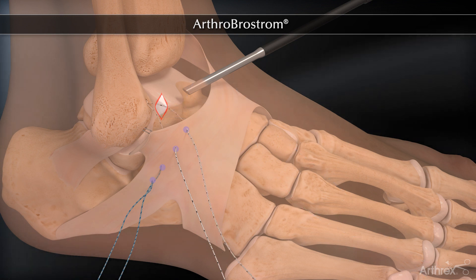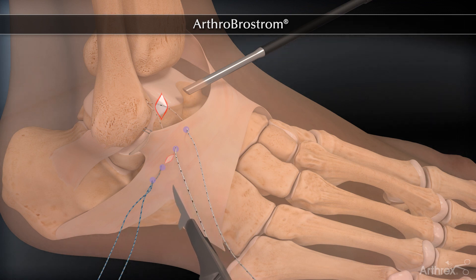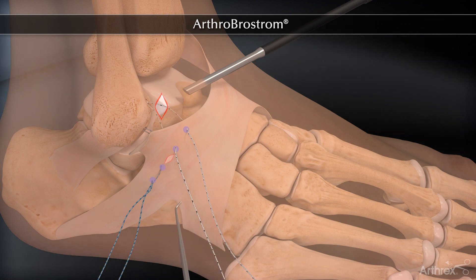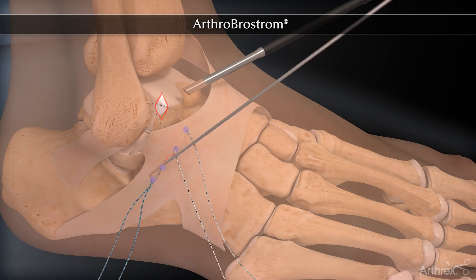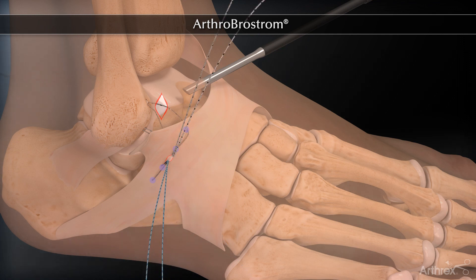A small incision is placed along Langer's line. Using a small arthroscopic probe or hemostat, the sutures are then pulled through this centrally placed incision. If distraction is being used, it is removed and the ankle is held in a slightly everted and neutral to slightly plantar-flexed position.